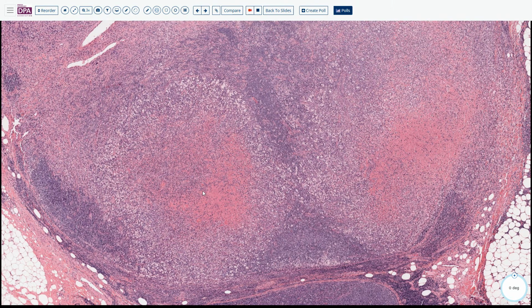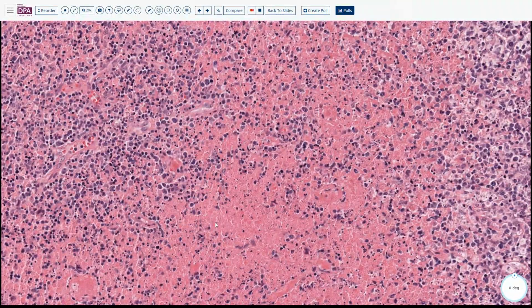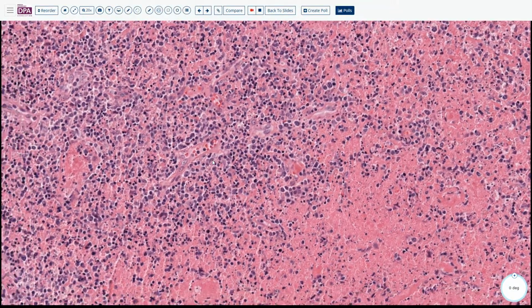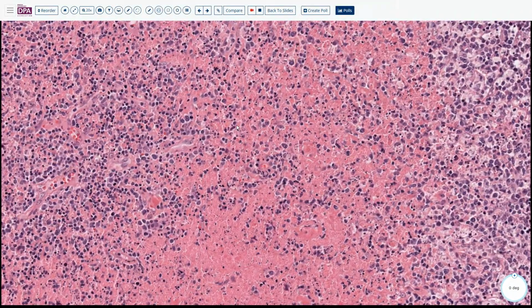But in comparison to the necrotizing granuloma pattern like the cat scratch, they also have this necrotic area. But other than this karyorrhectic debris, you could not find neutrophils. So this is one of the features of this kind of disease. And then these histiocytes are kind of forming this question mark shape.